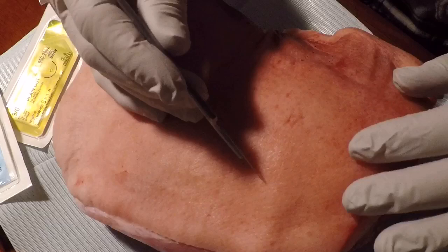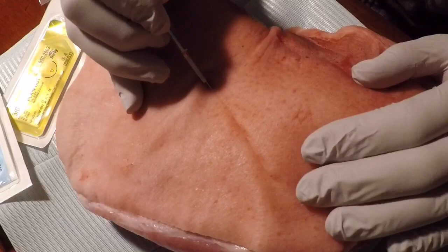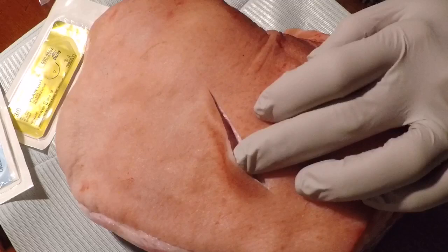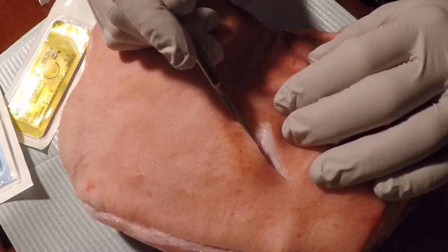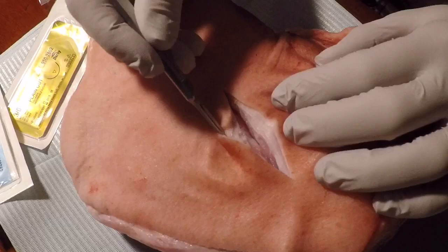This is the skin with a deep laceration. When we look at the tissue, you have the outside layer — the dermis and the epidermis. The epidermis is the brown layer on the outside, and the dermis is the wider layer inside. Then you have the first fascial plane down here. It's pretty much a series of different layers as you go down. For the sake of this demonstration, let's make it a deeper wound — cut all the way down into the muscle. So we have to sew this up.